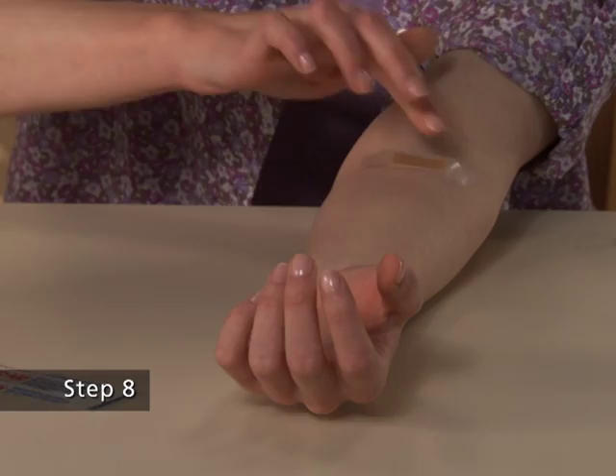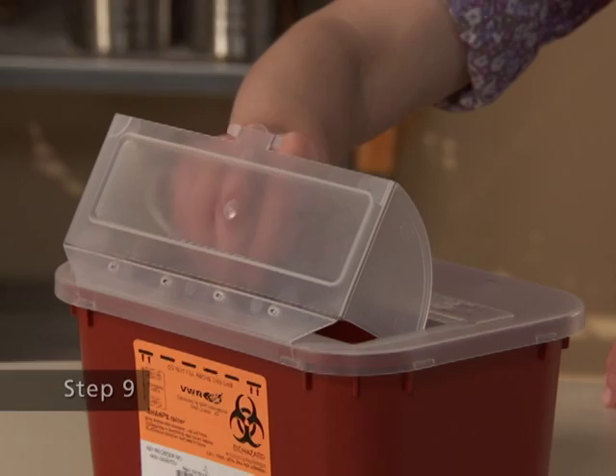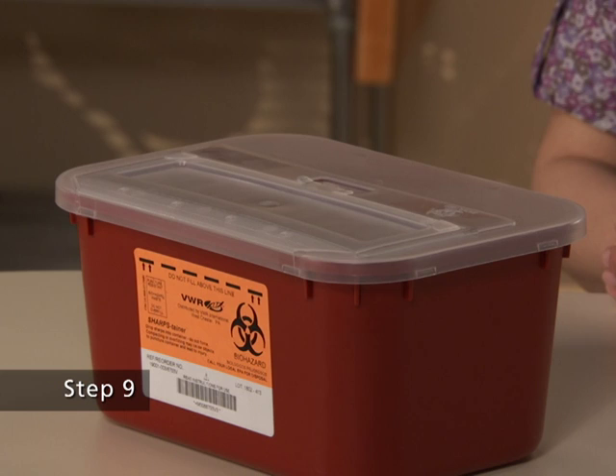The amount of drug product left in the infusion set will not affect your treatment. Step 9. Dispose of all unused solution, the empty vials, the used needles and syringe in an appropriate container used for throwing away waste that might hurt others if not handled properly.